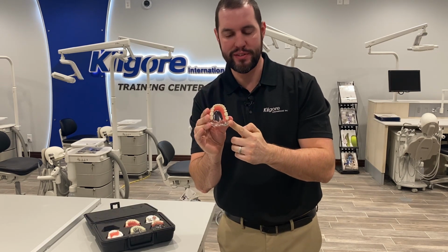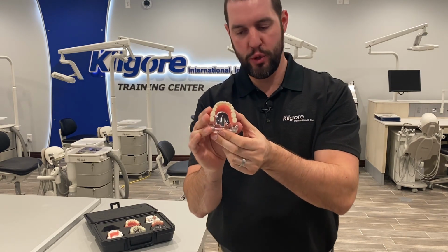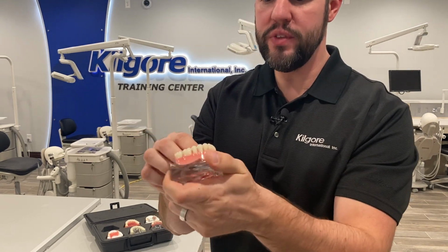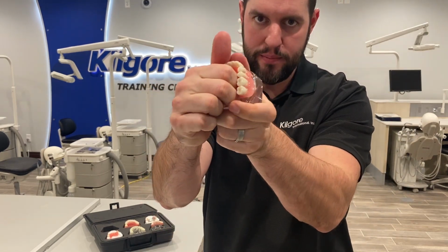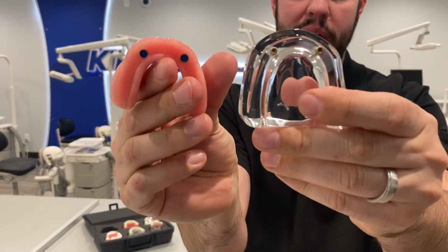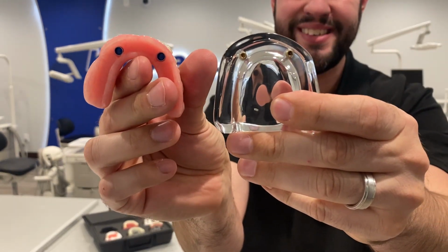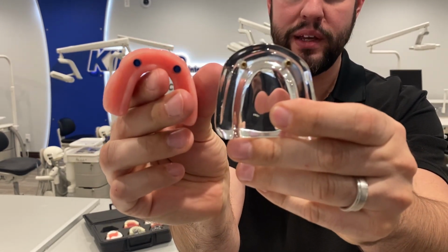And I love this thing because it's so tangible. It's a great way to explain to patients the benefits of implants. So I'm gonna get a little bit closer here for you. To remove this denture, all you have to do is take your 2 fingers here and pop it up. Now you'll see on here, you have the 2 Zest locators, actual Zest locators, as well as the blue couplings.